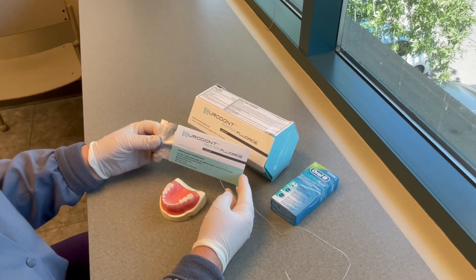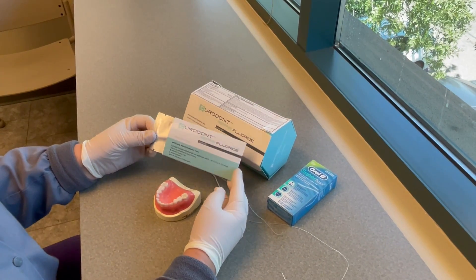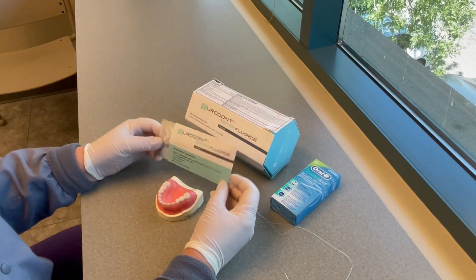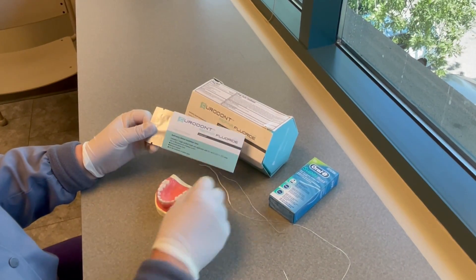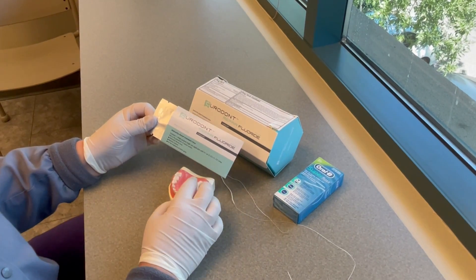This is the new Curodont treatment for incipient caries lesions — non-cavitated lesions — that I've been posting about and getting a lot of questions about. One question in particular was whether you could apply it proximally to incipient proximal lesions.